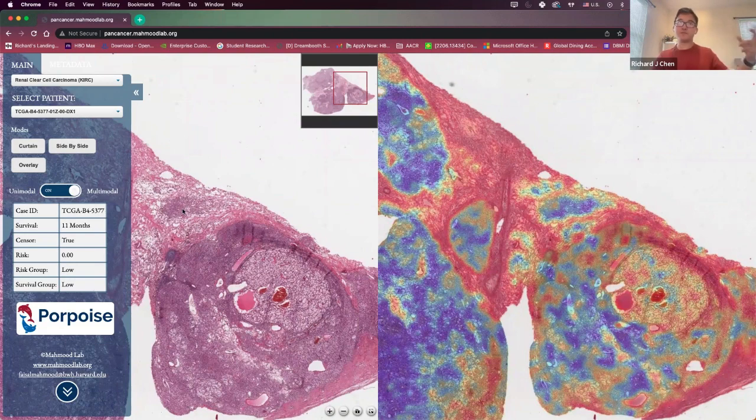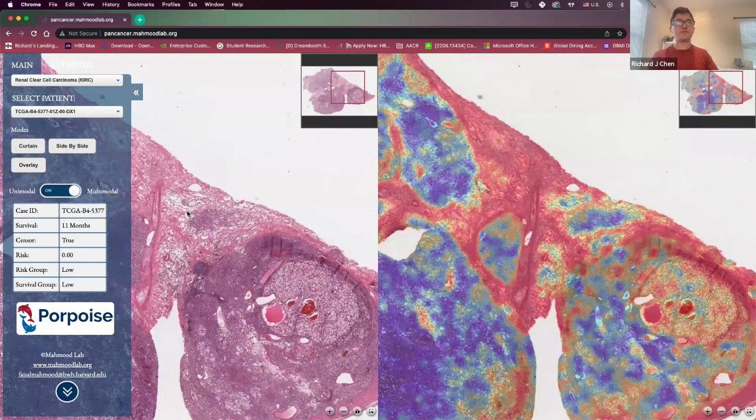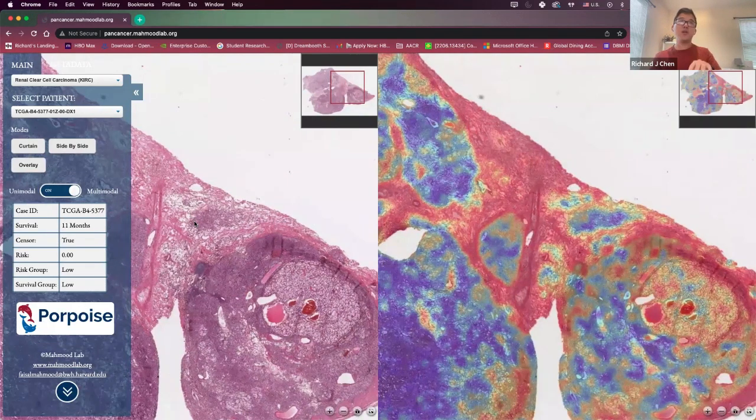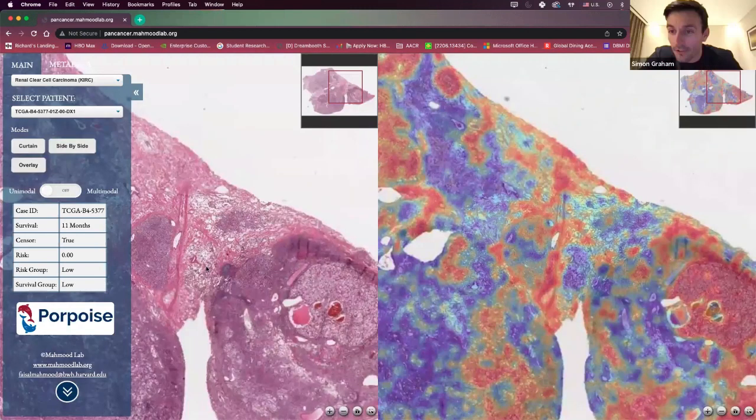So this is where, for multimodal learning, you would want to do interpretability on those cancer types, and you'll find very different kinds of information. This is all my hypothesis on what's going on, but I think it's a very cool thing to see. So it's a very interesting hypothesis.